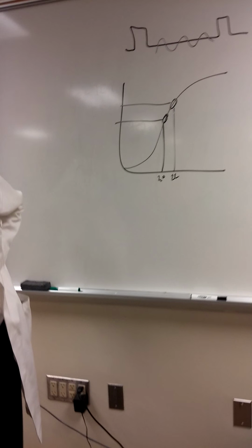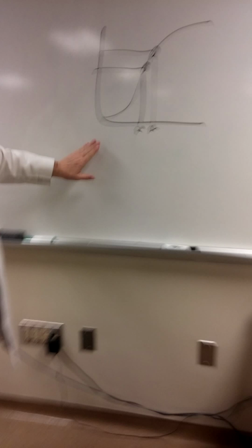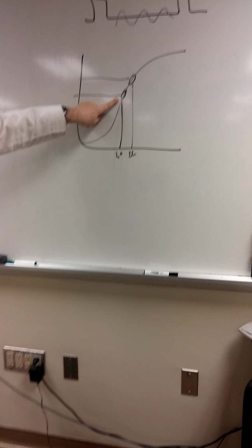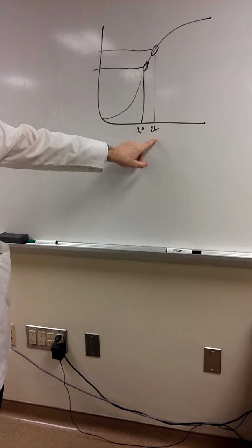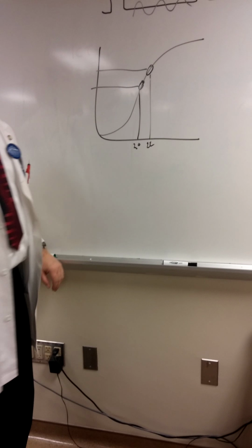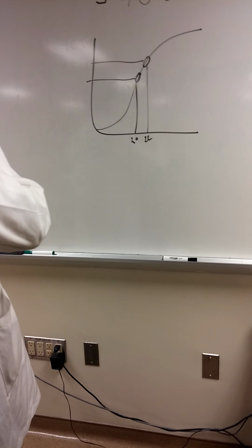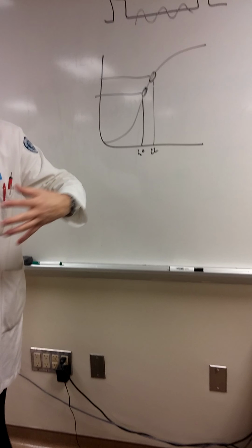Okay, two ways you can improve spontaneous tidal volume. One is just add some pressure support to that breath. A better alternative, though, is maybe just go up on the pressure that you're at, your P high, because as you go up, I'm pushing into a more optimal spot on the pressure volume curve. In other words, for a given amount of effort, they're going to generate a larger tidal volume because their lung is more compliant.